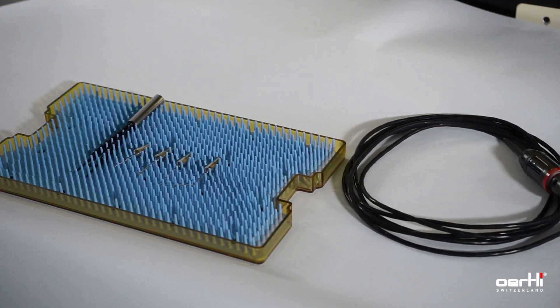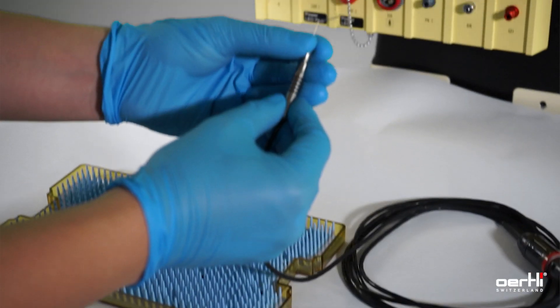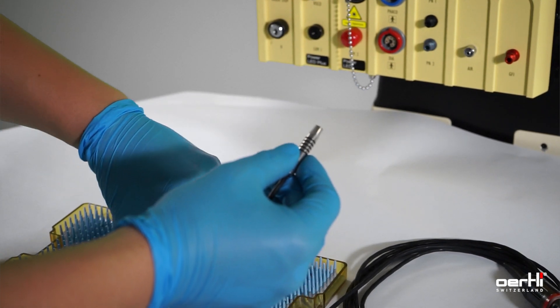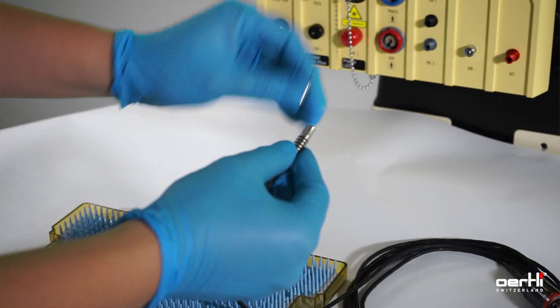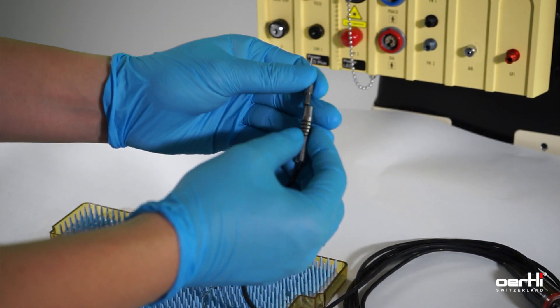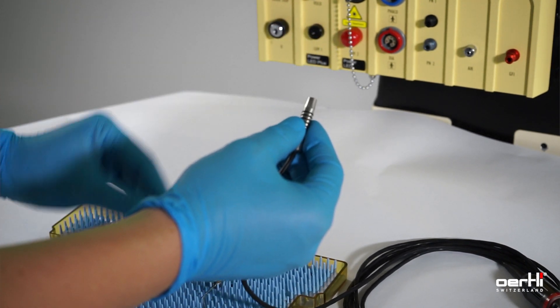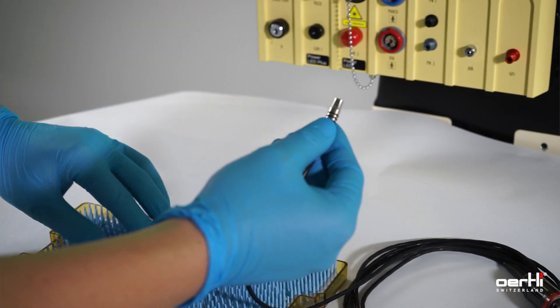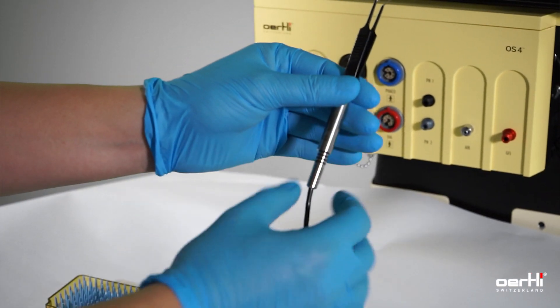Whenever you need the diathermy function — either for HFDS or endo-diathermy in 23, 25, and 27 gauge, eraser tip, capsulotomy, or the bipolar forceps — the procedure is always the same.